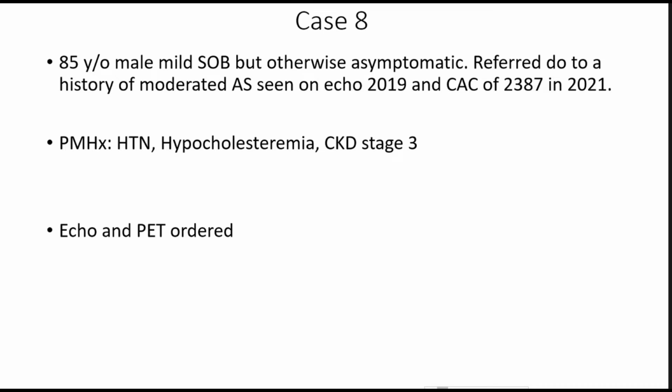Does anyone have any idea how we could have defined with echo whether or not those echo-free spaces were infected or not? I've been doing echo a long time, Steve, and there's nothing that I'm aware of that would help us to sort that out. Yeah, I don't know of anything.